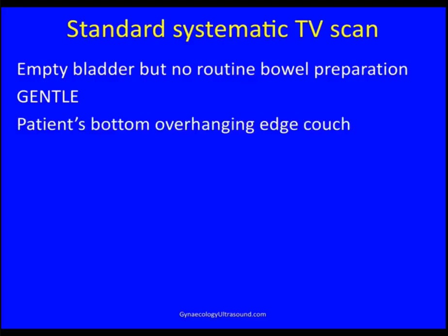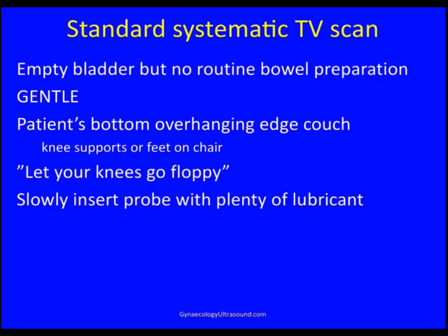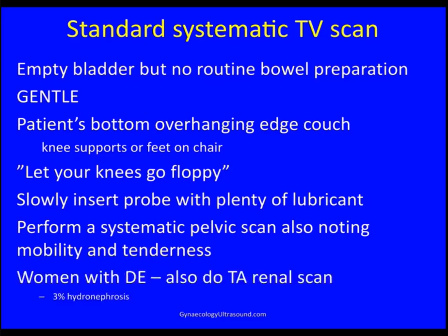The patient's position is also incredibly important. You need to have her bottom overhanging the edge of the couch a little bit with knee supports or feet on a chair. And then I always ask the patient, please let your knees go floppy, and that is incredibly useful. Then you very slowly and gently insert the transvaginal probe with plenty of lubricant, and then perform a systematic pelvic scan, noting also mobility and tenderness.